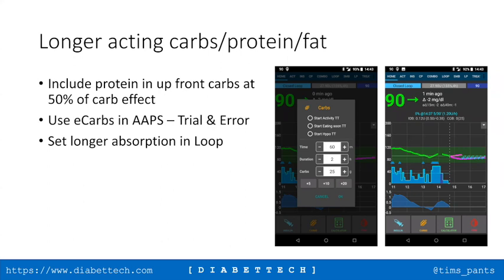We're just really struggling. We need the equivalent of what we were doing before, some extended bolus, instead of having to manually give chunks of insulin at a time, because she's just getting so many roller coasters. Yeah, I have to admit, I don't think there's a great answer for that.